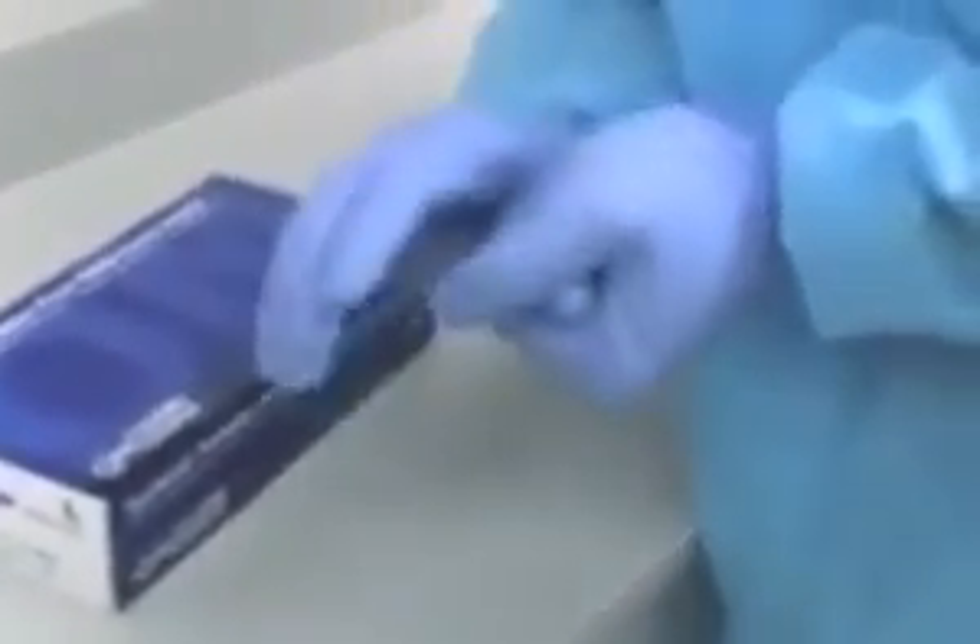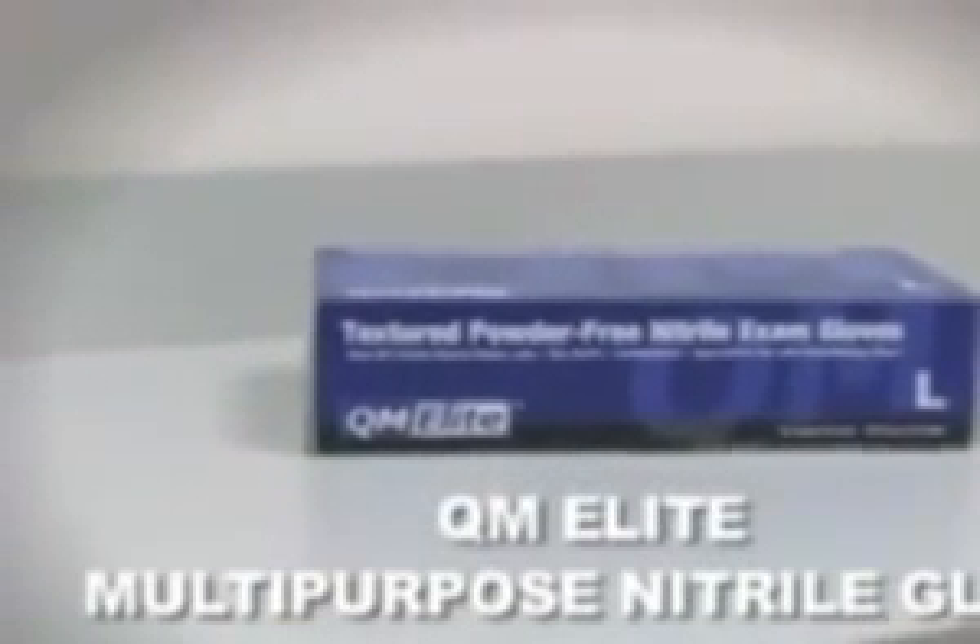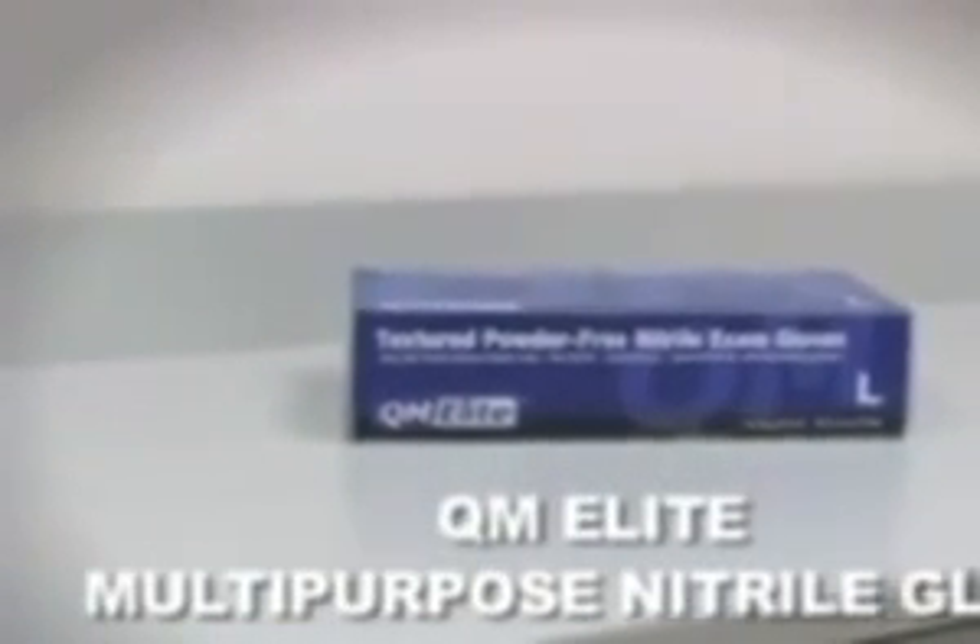For healthcare providers, the QM Elite Glove has textured fingertips, the feel of latex without the allergy risks associated with latex — a glove that will fill the need for most non-sterile medical procedures.